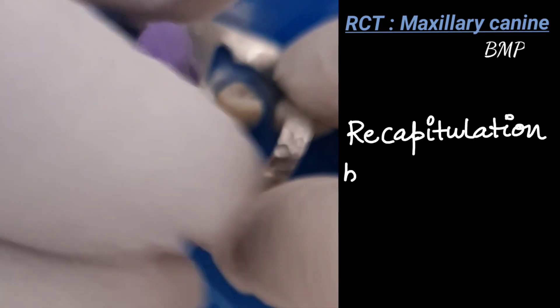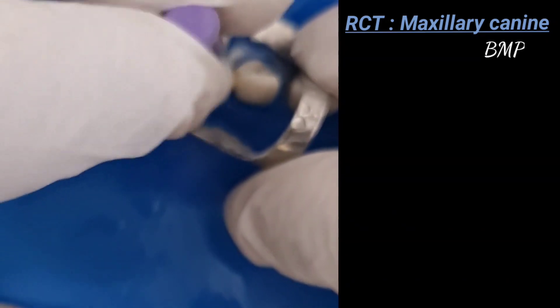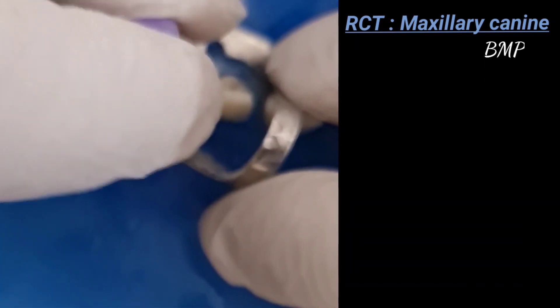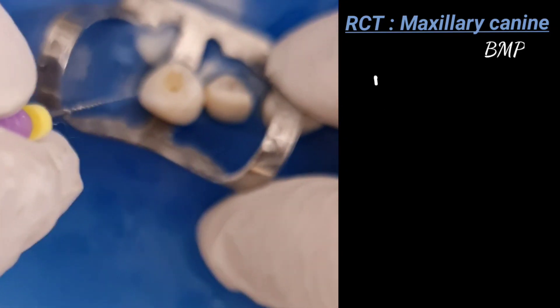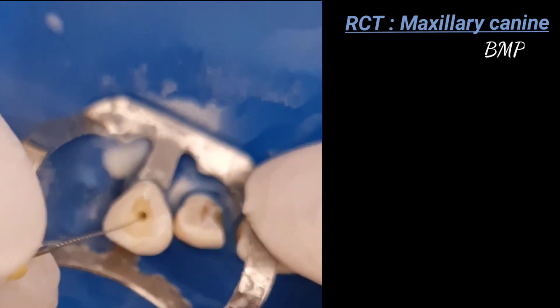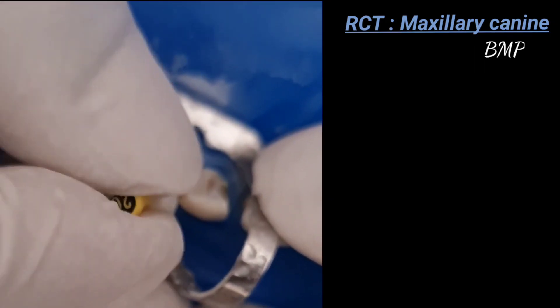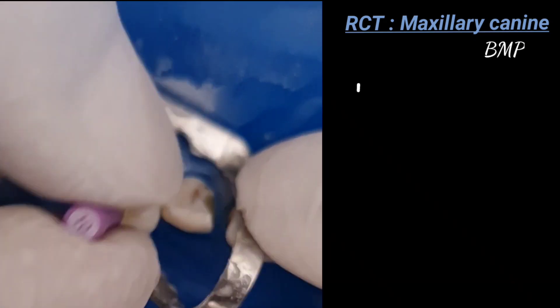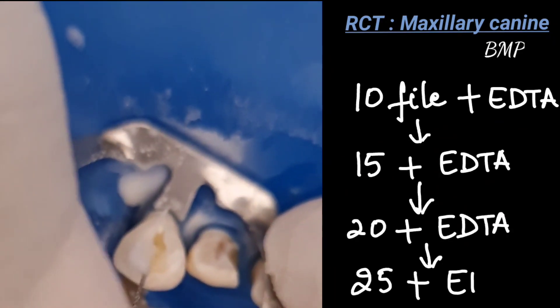Recapitulation between each size is done by returning to a smaller instrument from time to time before advancing to a larger size. Every time we insert any file into the canal, we use EDTA along with it to shape the canal. After the number 10 file, we use the number 15 file. For apical one-third in the step-back technique, we use files 10, 15, 20, and then 25, each with EDTA, keeping on increasing file size up to number 25.